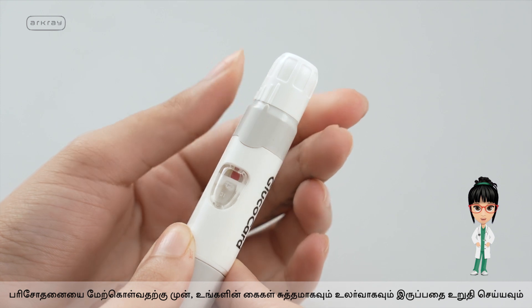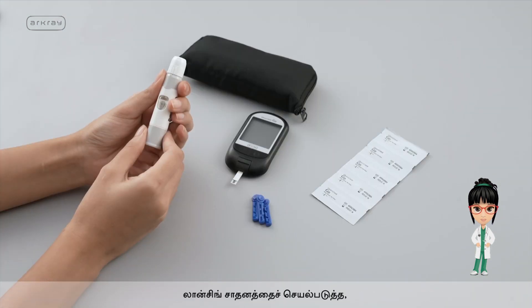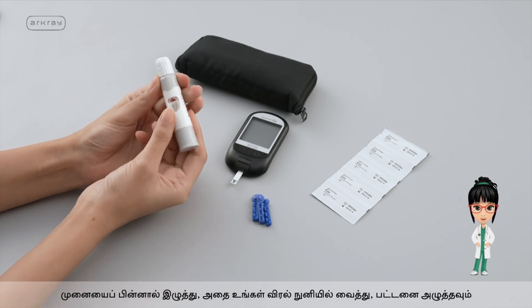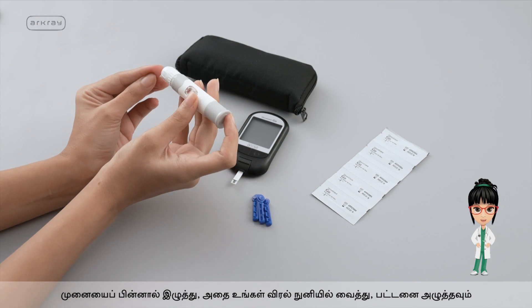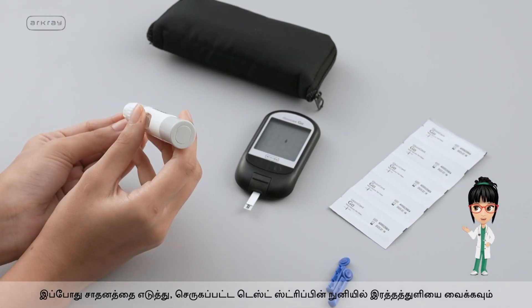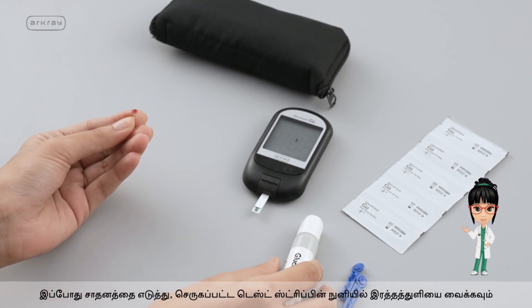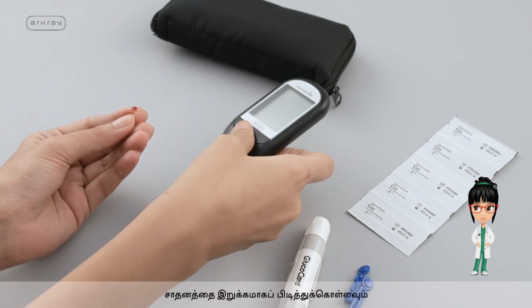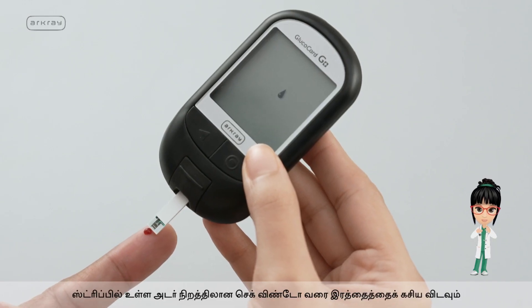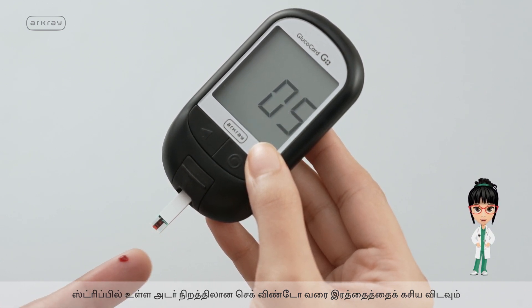Before performing the test, ensure your hands are clean and dry. To activate the lancing device, pull back the end, position it at the tip of your fingers, and then press the button. Pick up the device and smear the inserted test strip tip with the blood drop. Hold the device tightly with your fingertip and allow the blood to seep onto the dark-colored check window on the strip.